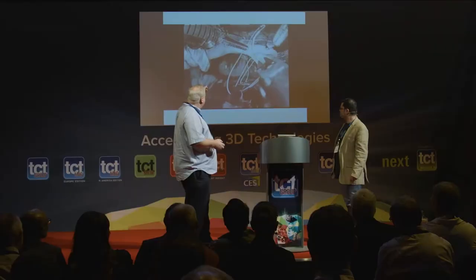So this is me in my office. So we run a very large robotics cardiothoracic service in the UK. In fact, we run the largest. We've done about 700 operations. And I've included this video to show you one of the issues that we have. Stitching when the chest is open or in any other part of the body is relatively straightforward when you have easy access. But the limitations of the robotic instruments, as you can see, are the stripy instruments. Trying to pass a needle through a tissue, capturing the needle and then repositioning, it's a big challenge.